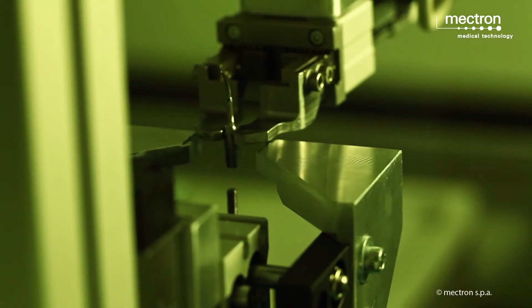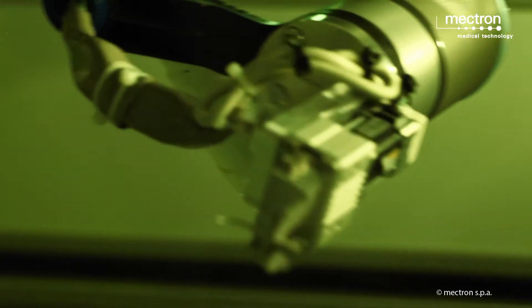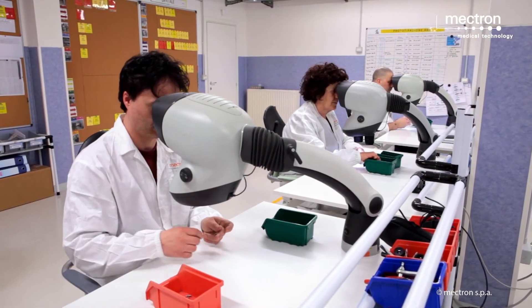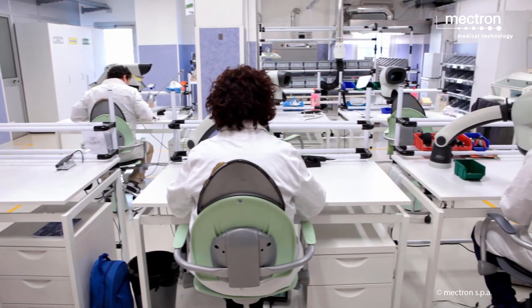Subsequently, the inserts proceed with a laser marking step. After this production step, all inserts are washed to remove residues and are carefully cleaned.